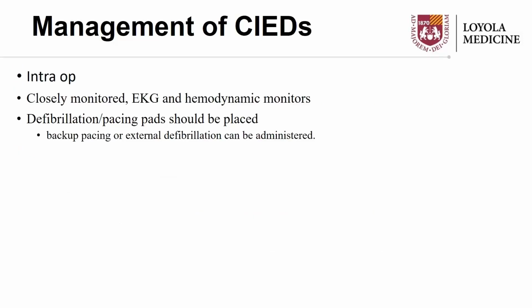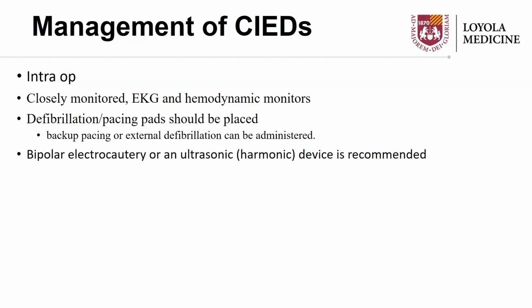Intraoperatively, cardiac monitors should always be placed to monitor changes in pacing behavior. Also, defibrillation and pacing pads should be placed on these patients' chests in an anterior-posterior configuration so that if malfunction should occur, you have a backup pacing or external defibrillation readily available.